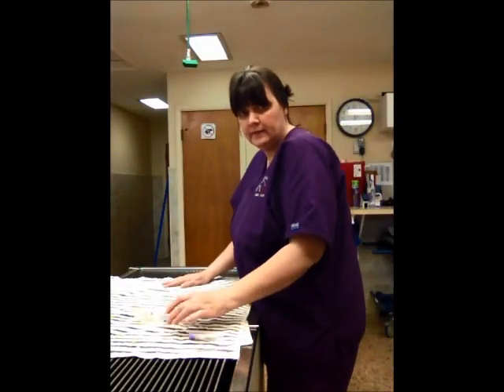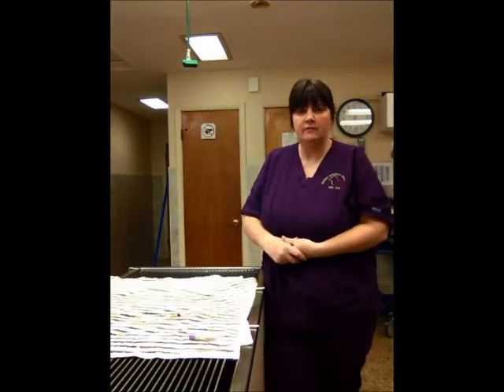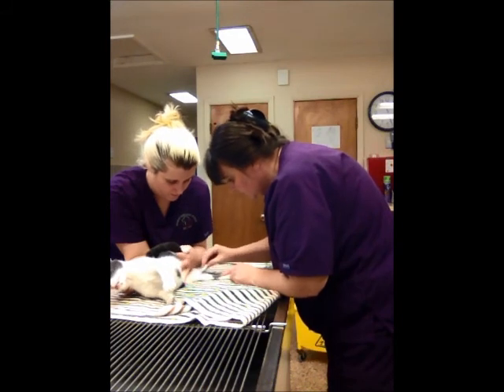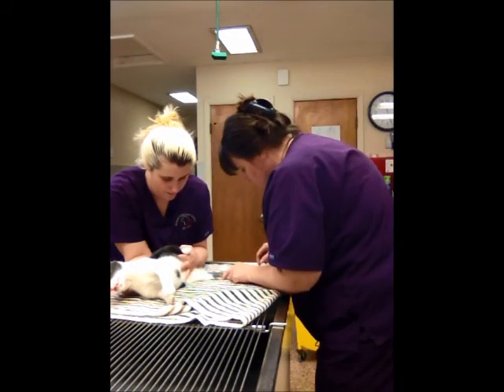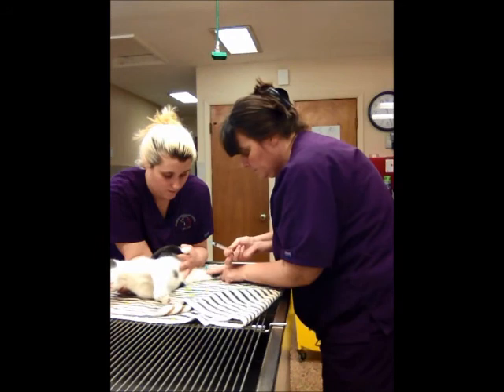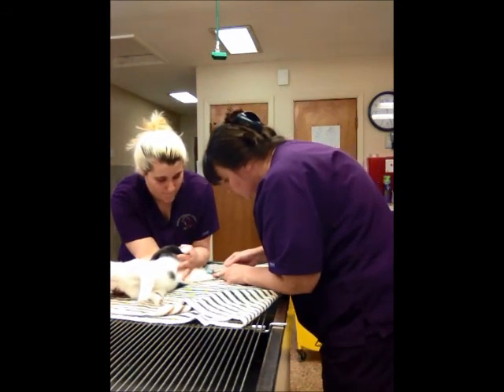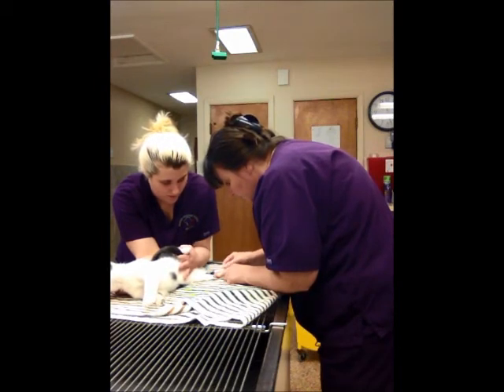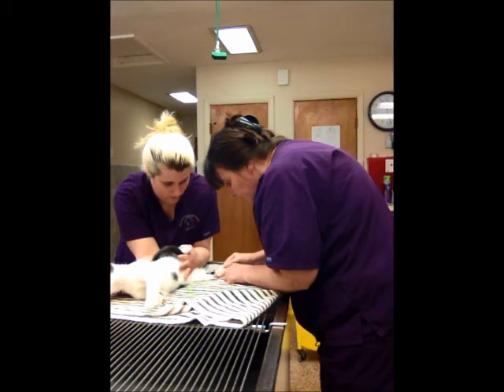When our kitty cats come back, we're going to draw blood on her medial saphenous vein. Double up. Not much, but a little.